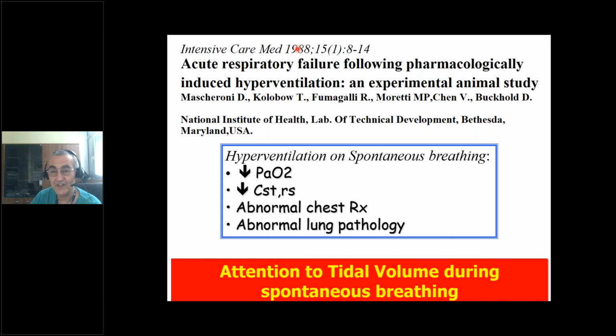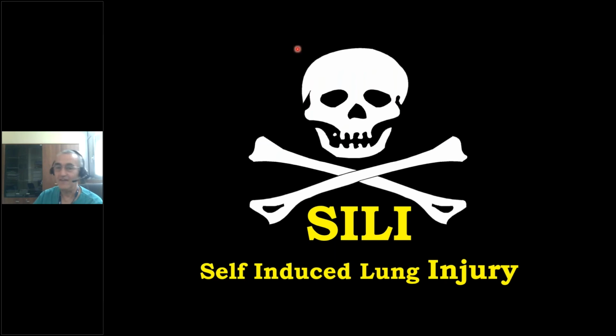The first clinical message is that we have to be very careful with tidal volume, not only during controlled mechanical ventilation, but also during spontaneous breathing. In fact, usually you think about the term VILI, ventilator-induced lung injury.